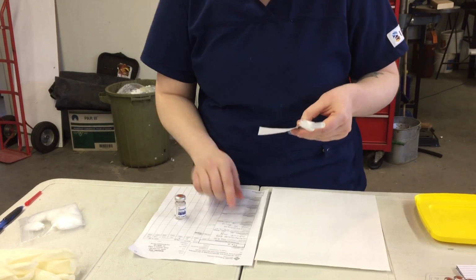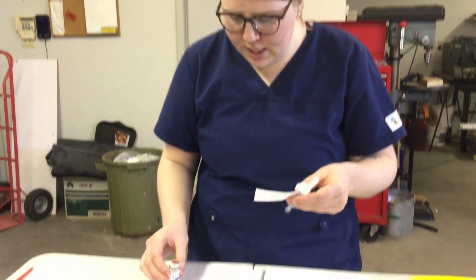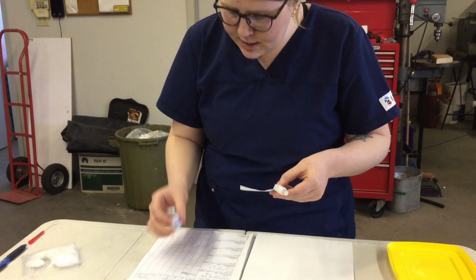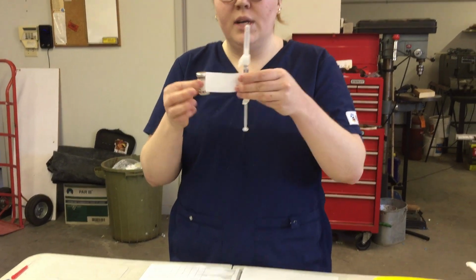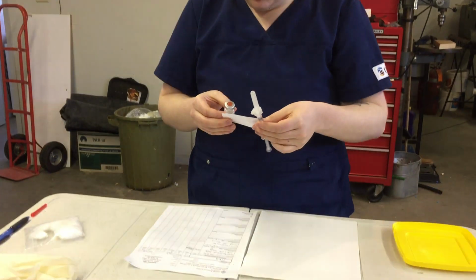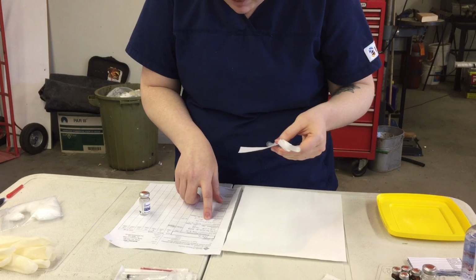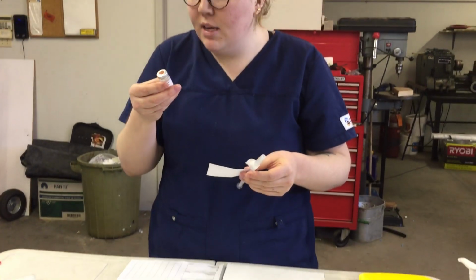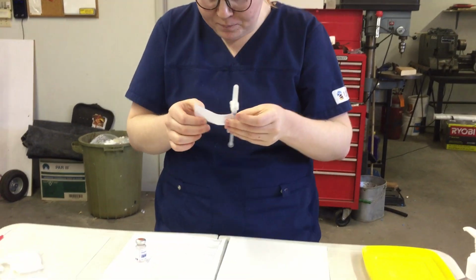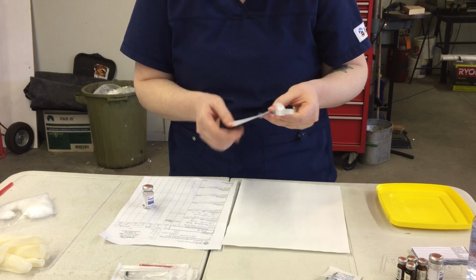So we have dimenhydrinate, this is dimenhydrinate, that's correct. And then we have dimenhydrinate in the syringe. We have 150 milligrams. This is 50 milligrams per ml. So we're going to need 3 mLs of the solution, which is what I have here with no bubbles. So that is the correct dose of 150 milligrams, so that's correct. We have intramuscular, this says that it can be given intramuscular, and this is in fact an intramuscular syringe, so that is correct. It's to be given daily, so it's written here 2100. I have the time here is 2030.